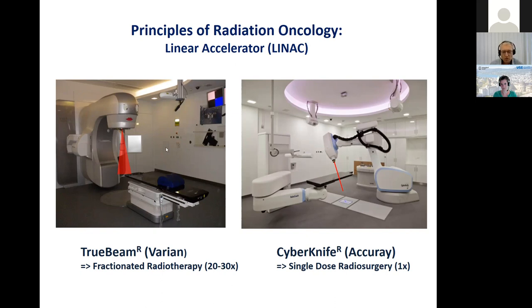And the machine that is used for this purpose is a linear accelerator. This linear accelerator produces a conic beam, and this beam is directed to the patient's tumor. This machine can be turned around, so the direction can be varied, and all these beams somehow meet within the tumor of the patient. These radiation fields may be quite large. They may be 2 centimeters, 3 centimeters, but most of them are 5 to 10 or 15 centimeters in diameter.